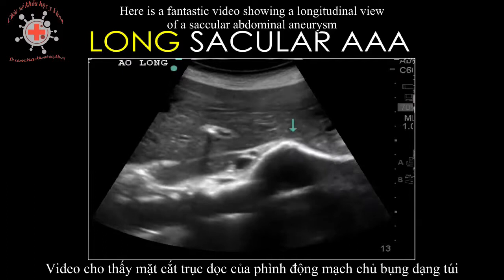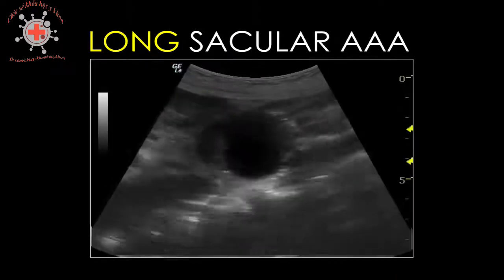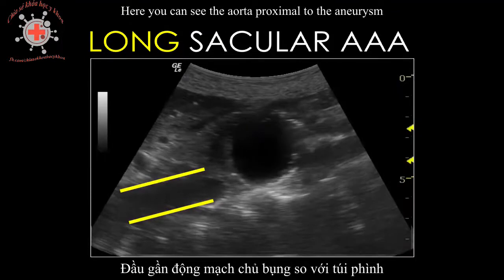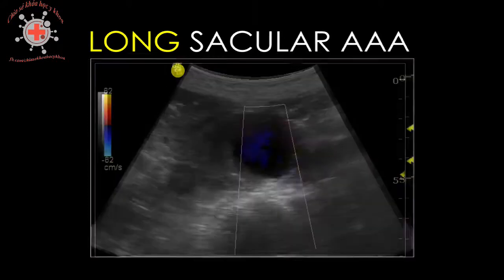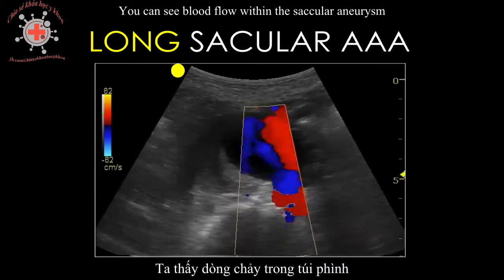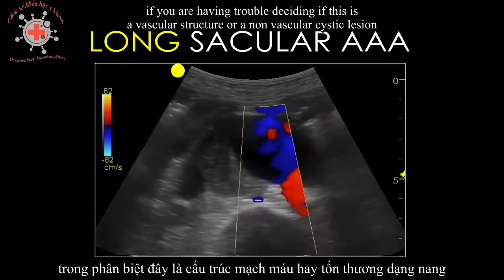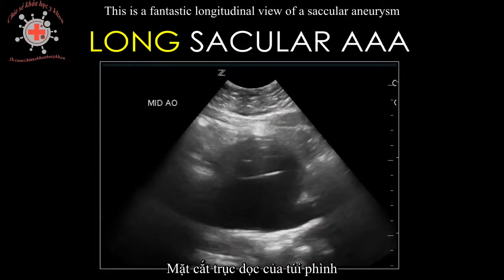Here is a fantastic video showing a longitudinal view of a saccular abdominal aneurysm. This video shows a longitudinal view of a saccular abdominal aortic aneurysm. Here you can see the aorta proximal to the aneurysm. This is the aorta distal to the aneurysm. When color flow is applied, you can see blood flow within the saccular aneurysm. This can often be important if you are having trouble deciding if this is a vascular structure or a non-vascular cystic lesion. This is a fantastic longitudinal view of a saccular aneurysm.